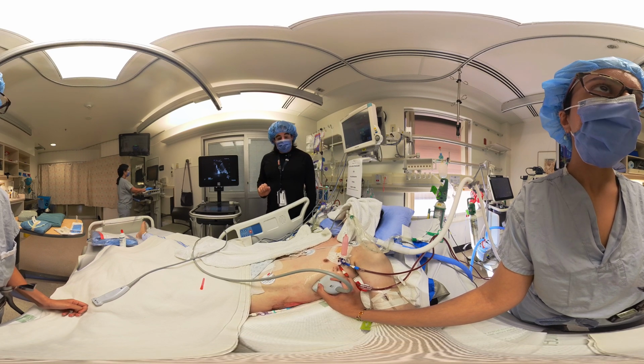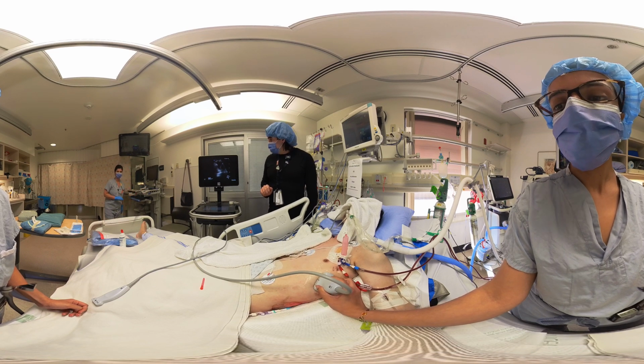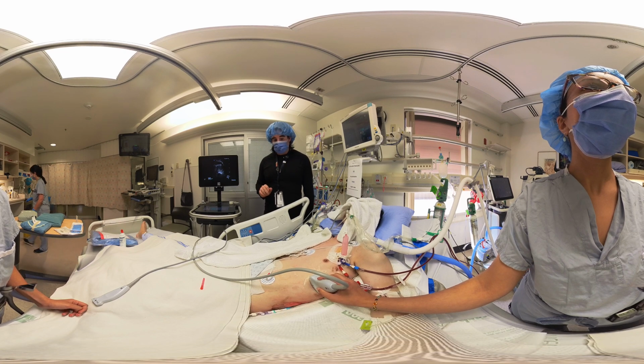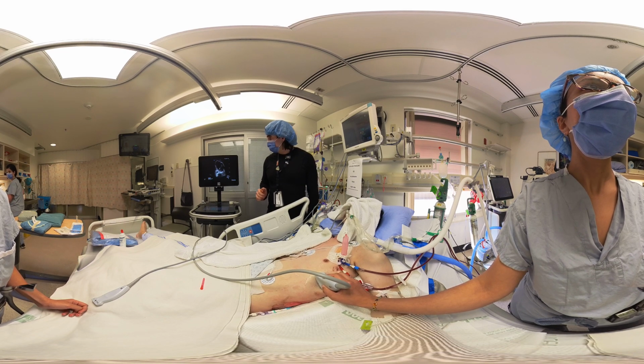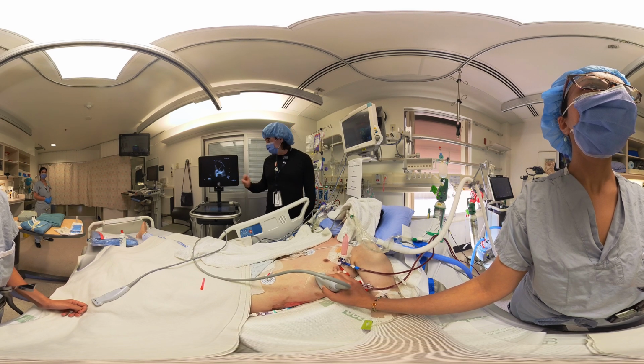But let's move the probe now 90 degrees, marker towards the ceiling. Yeah, marker towards ceiling, that's good. And let's just make sure that on both axes we have enough space. Let's go a little more superior. There we go, that's a nice anechoic space, so we have a good distance there, at least 4 centimeters for needle entry, that's very safe.